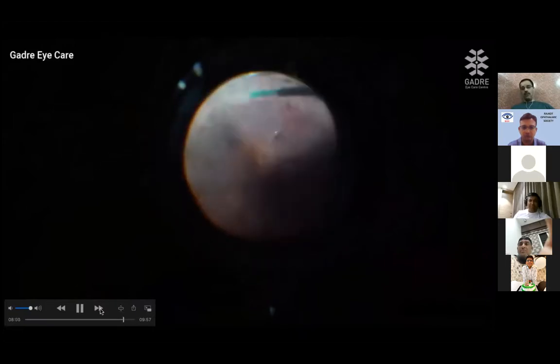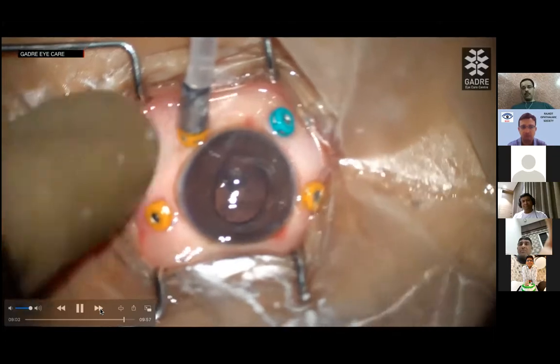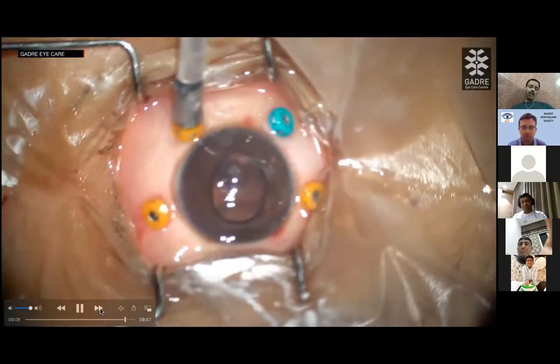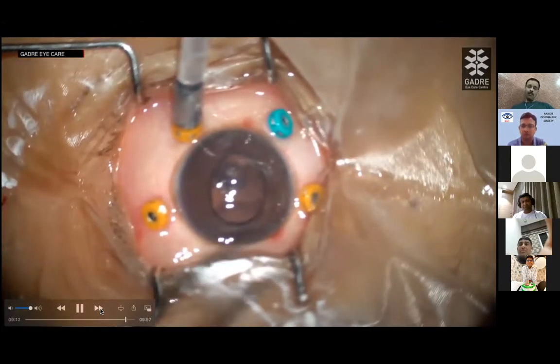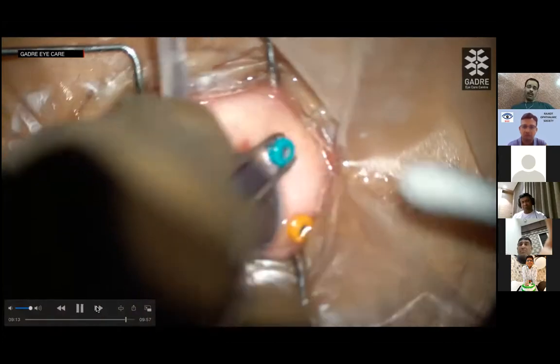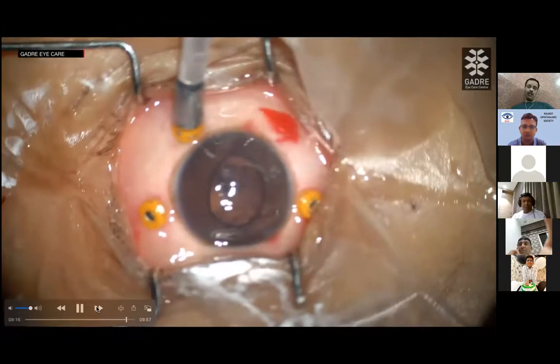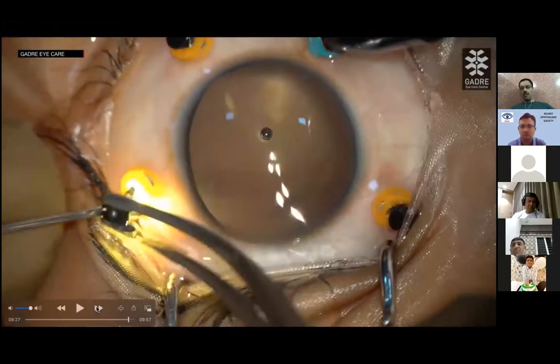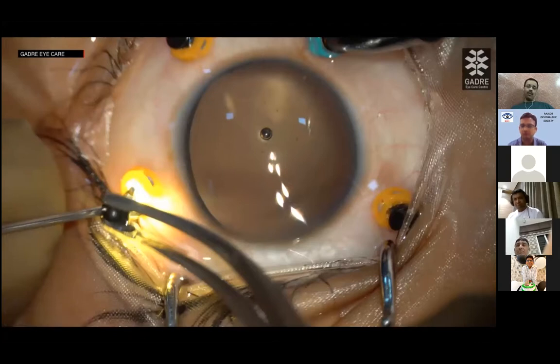On follow-up, about the 20th day, there was again curling of the inferior and the nasal edges. This was about 1.5 months prior to this surgery, and the child needed a repeat surgery for a recurrent RD, which was done today, in fact. The problem was that the child was not positioning. They were positioning prone only about 1 to 1.5 hours a day, in spite of repeated efforts by the parents. They were keen to try something for vision. The vision was counting fingers at 1 meter at that point.